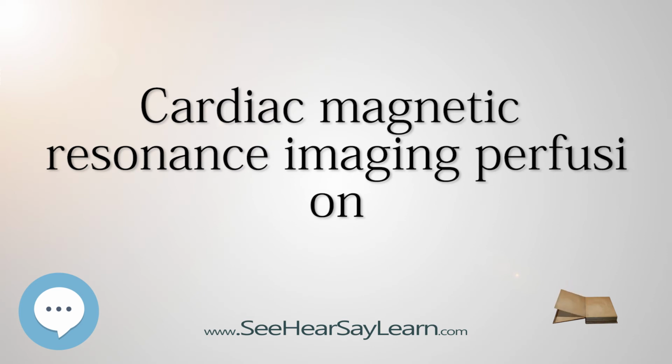Adverse events. It is common for the patient to get a number of mild symptoms when they are given the adenosine infusion, such as feeling hot and sweaty, short of breath, nauseous, and noticing that their heart is beating faster. These, if they occur, resolve rapidly, normally within 60 seconds, after the adenosine infusion has stopped. There are a number of more serious and much less common side effects, including transient heart block, bronchoconstriction, and a 1 in 10,000 risk of anaphylaxis caused by the gadolinium contrast agent. These can invariably be successfully treated with no long-term side effects.